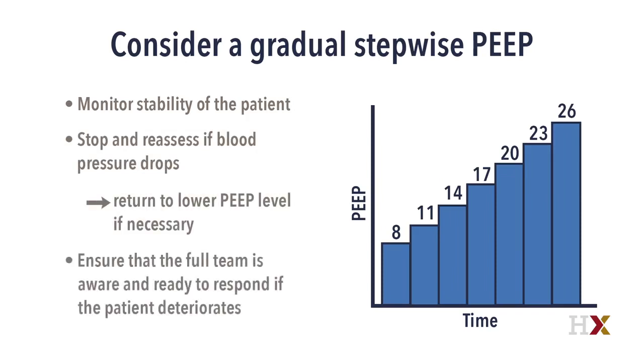A recruitment maneuver should never be done without the full team aware and ready to respond if there is any deterioration. For further information about recruitment maneuvers, please see the written materials.